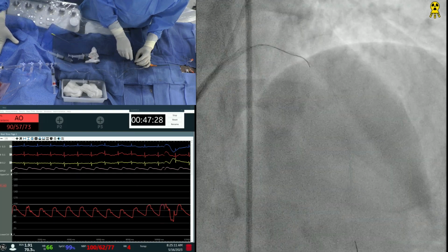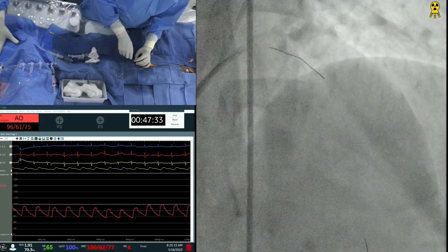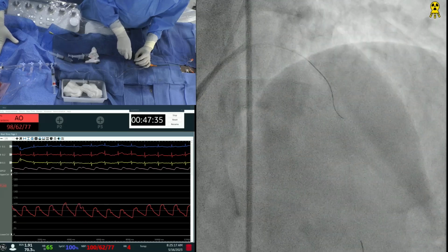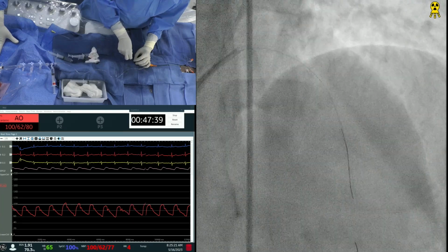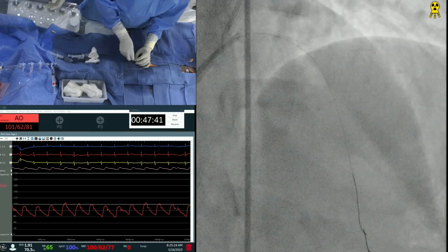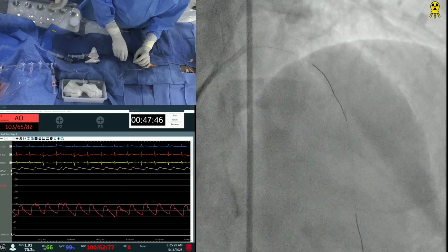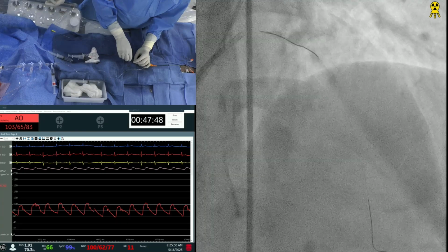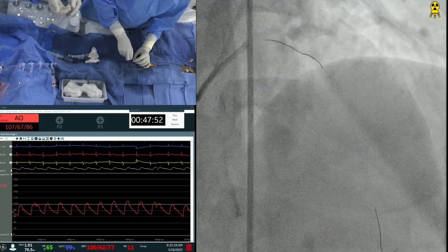The question people always ask is, now you're going to do a dilatation. So I always say put your wire in the side branch, in this situation, in the distal. So you are still in there, not going through those cracks. Balloon, and monorail Venture, right? Or over the wire? Monorail is good.